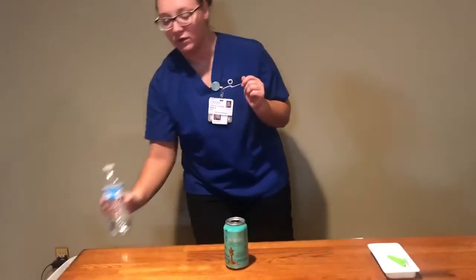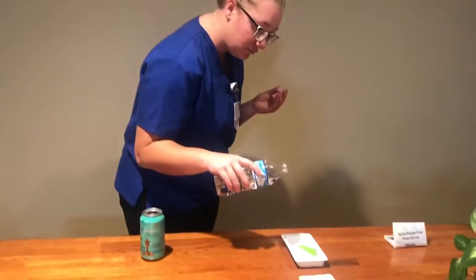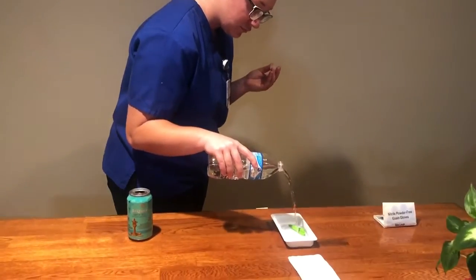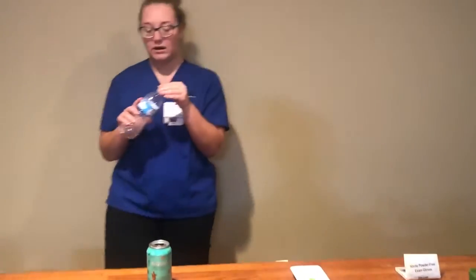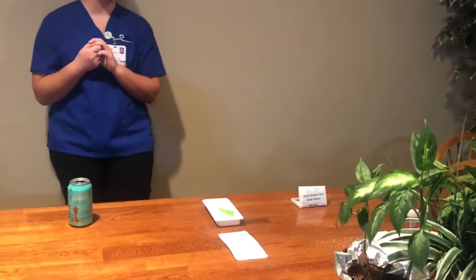Now I'm going to open my solution, pour some in the trash, and then pour some in there to moisten my catheter. After that, I'm going to put on my sterile gloves.